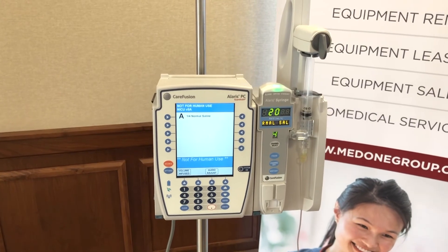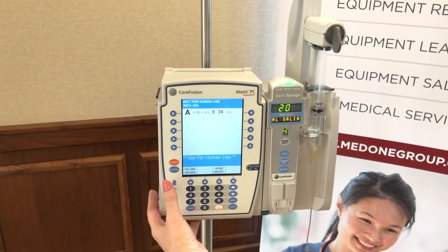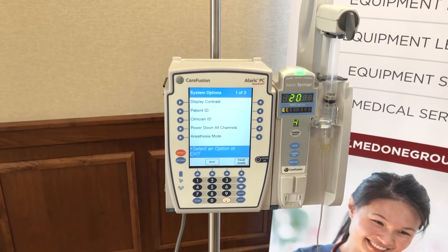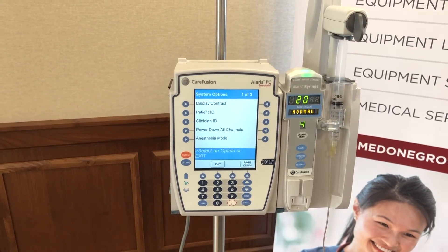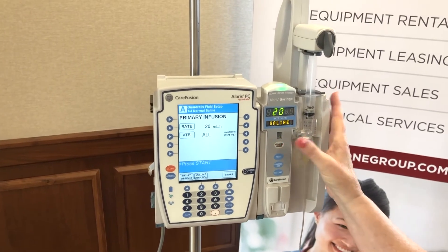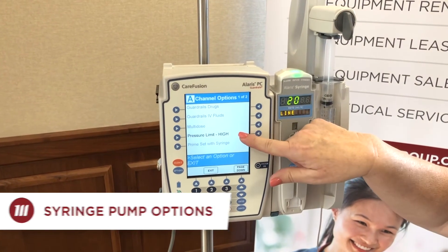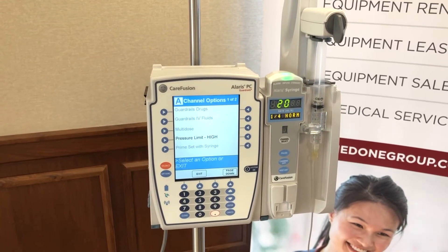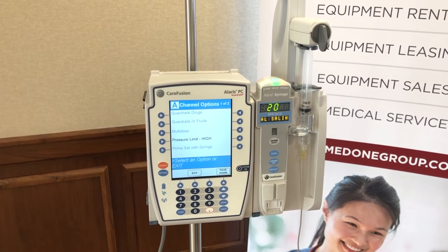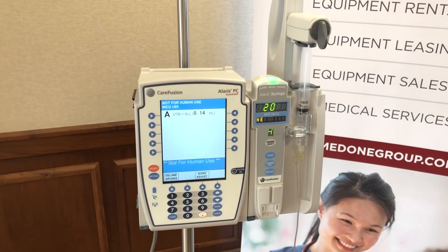A couple of things to keep in mind — the syringe pump has options. Press the blue options button below your silence button and you'll see: display, patient ID, clinician ID, power all channels down, and anesthesia mode. These are options on the brain or PCU. If you exit out and hit channel select on your syringe, you can view the syringe pump options. Notice pressure limit: you have three choices — low at 200, medium at 500, and high at 800 millimeters of mercury. Go back to the main screen and press start — everything is still running even while we reviewed those options.